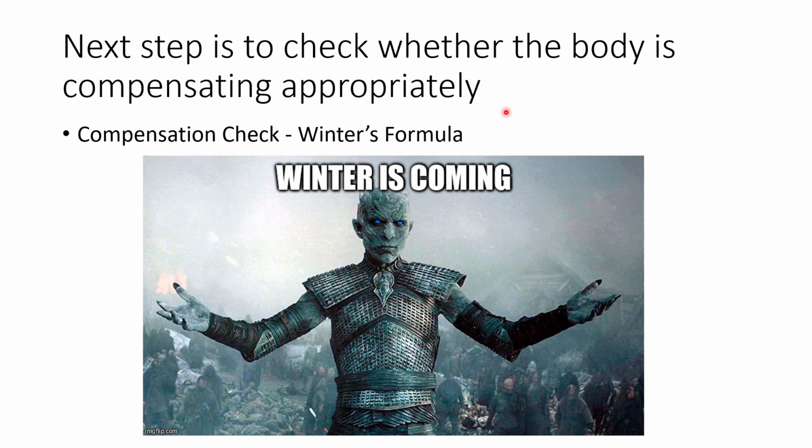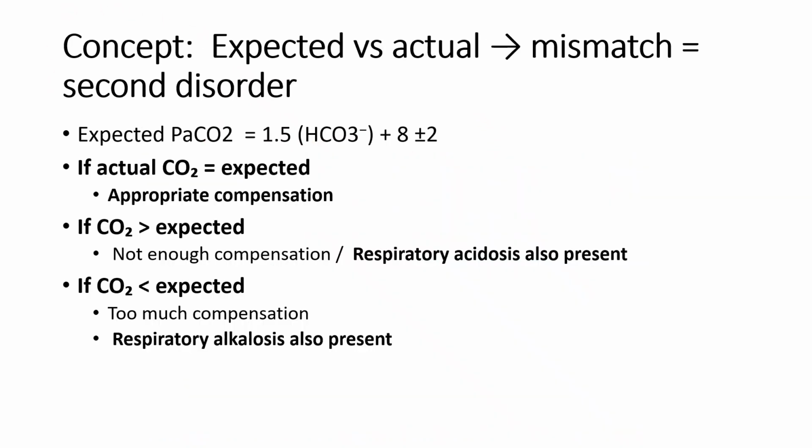Then once you have figured out that the patient has metabolic acidosis, you have calculated the anion gap and figured out that it is high anion gap or normal anion gap, then you check whether the body is compensating appropriately, and you do it with a formula which is known as Winter's formula. So how you do it is you check whether the value matches what you calculate. If they match, then the body is compensating. If it is not matching, either it is partial compensation due to some damage to the organ that is supposed to compensate, or there is also the presence of a second disorder.